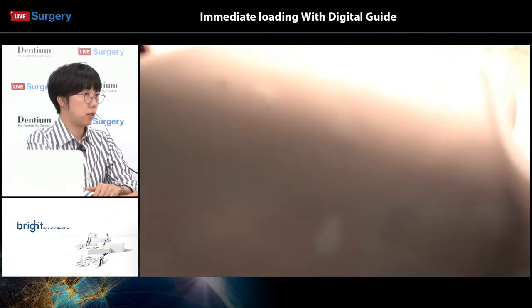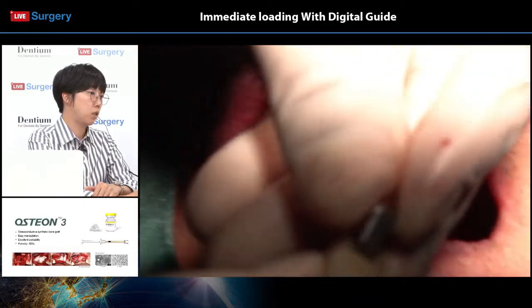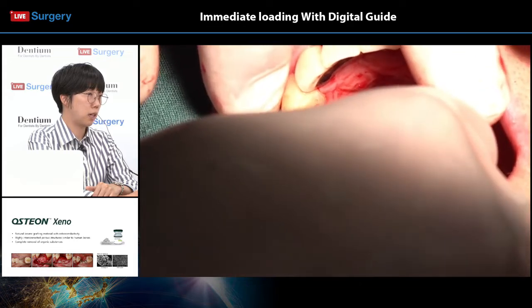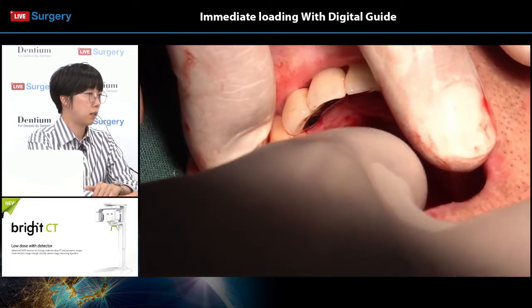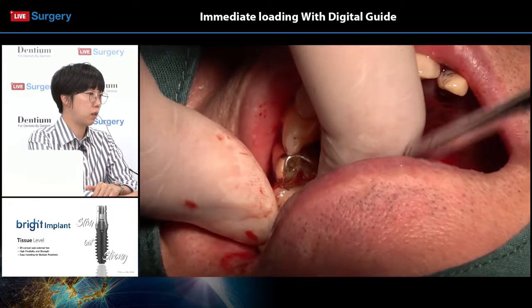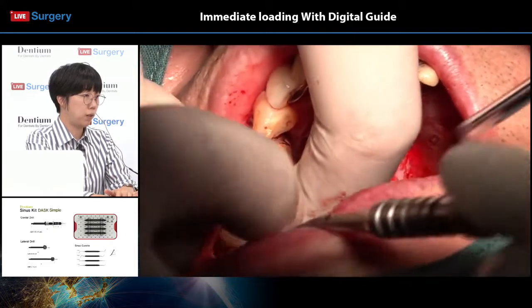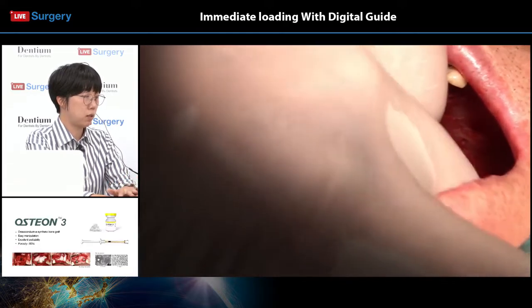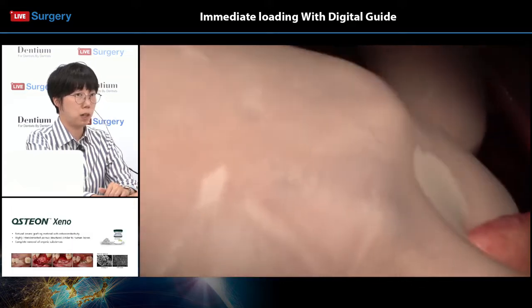So what you're seeing now is that Dr. Lee has attached the abutment to the temporary bridge, a 2-unit temporary bridge, and he is using this bridge as a positioning jig. If there wasn't a lot of position change of implants number 16 and 17, then the abutments would fit well. If not, then you would have to attach the abutments first, just manually, and then reline the bridge so that it fits with the abutment areas.